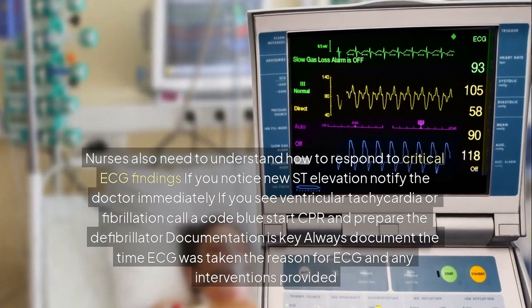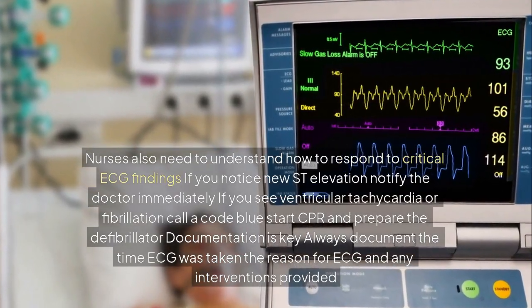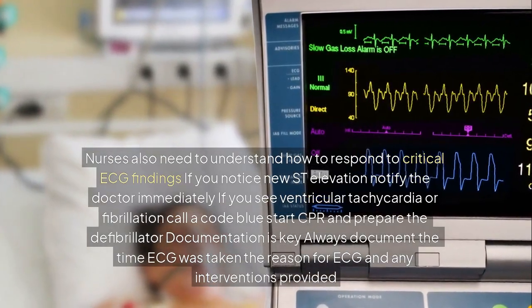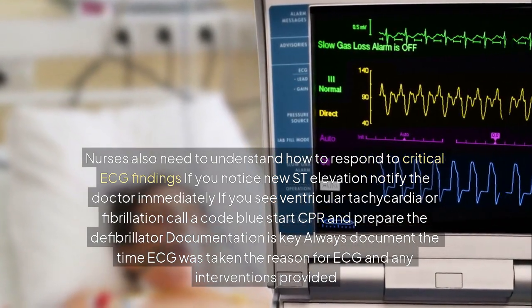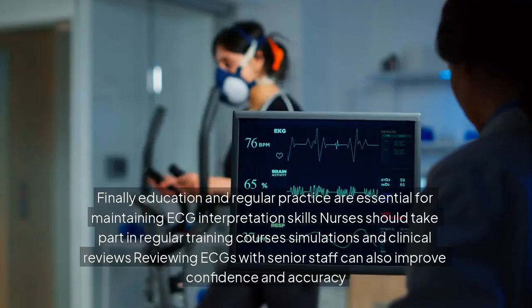Nurses also need to understand how to respond to critical ECG findings. If you notice new ST elevation, notify the doctor immediately. If you see ventricular tachycardia or fibrillation, call code blue. Start CPR and prepare the defibrillator. Documentation is key. Always document the time the ECG was taken, the reason for the ECG, and any interventions provided.